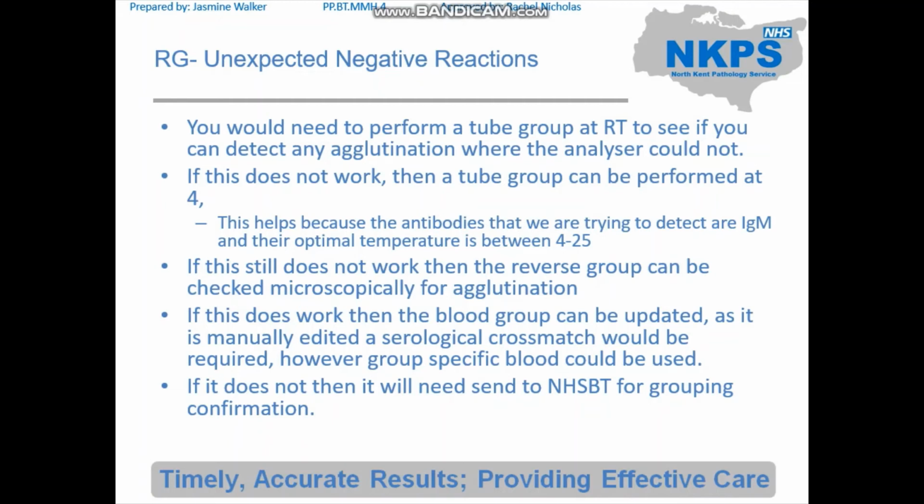If this does not work, then a tube group can be performed at 4 degrees. This helps because the antibodies that we are trying to detect are IgM, and their optimal temperature is between 4 and 25 degrees, depending on the antibody. If this still does not work, then the reverse group can be checked microscopically for agglutination.